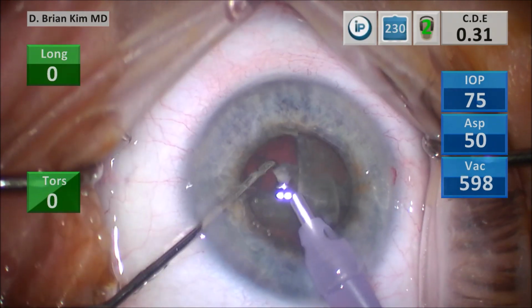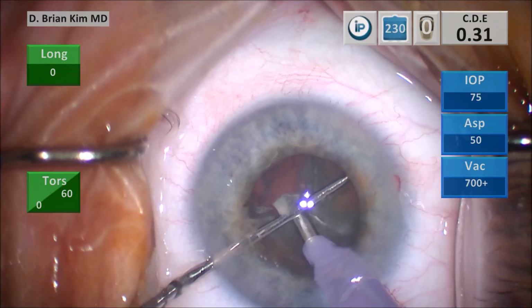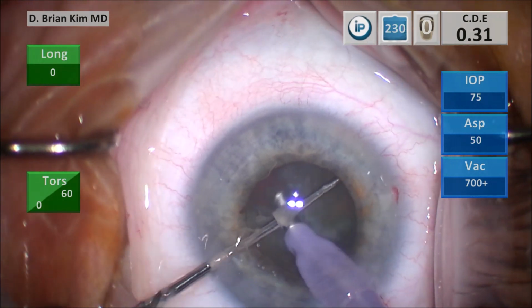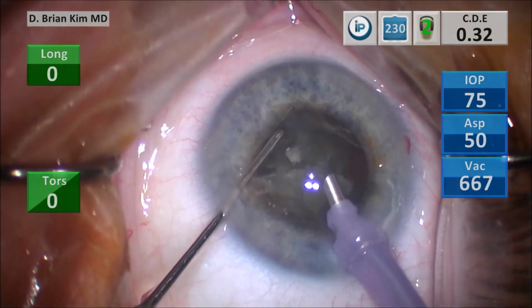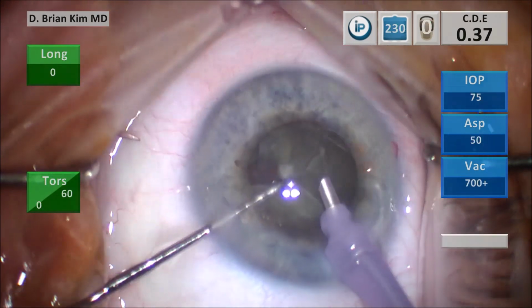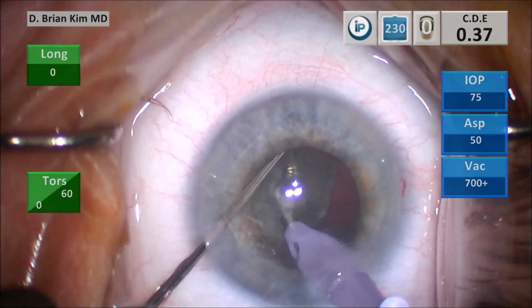I place the chopper out to the equator again to get around the second quadrant, and then I crush it against the phaco tip. You can see that because it's so sticky, it doesn't want to just come out of the bag. It's still stuck to the lens material. It's still in the bag. And so I had to go after it again and crush it and chop it again.